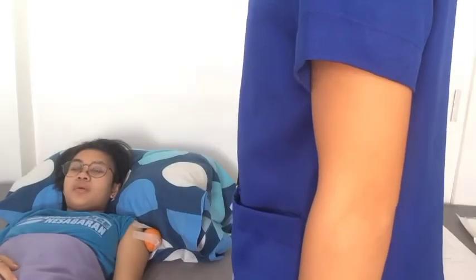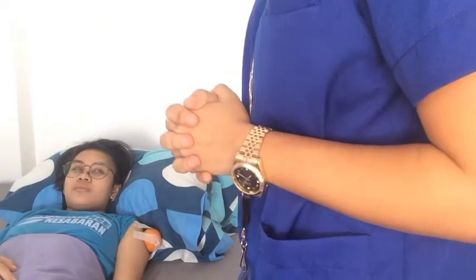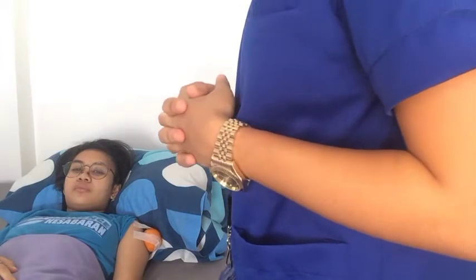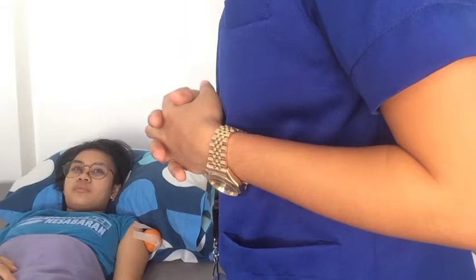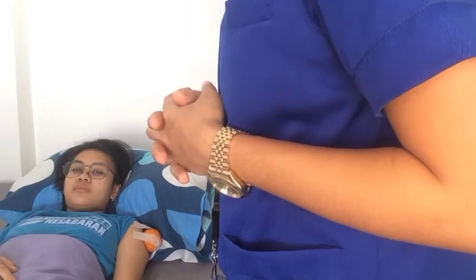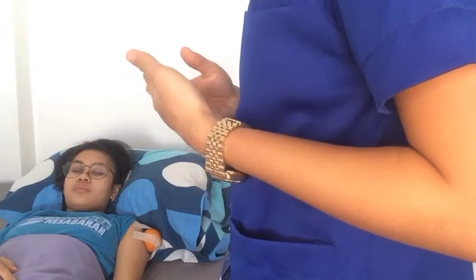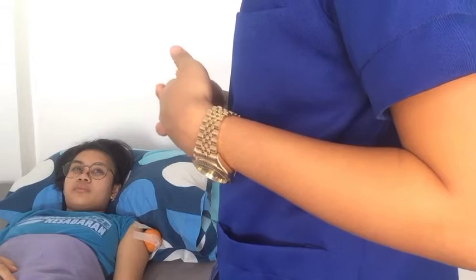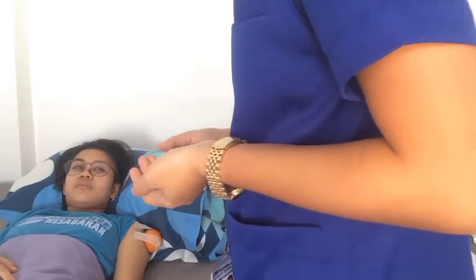So, how are you doing, ma'am? I'll now proceed with the administering of intramuscular injection. So, after preparing the patient and explaining the purpose of the medication and how it will help, using language that the client can understand, include relevant information about the effects of the medication. I've also explained to the patient the definition, the process, the procedure, and the possible side effects. So, I'll now select, locate, and clean the site of the area.